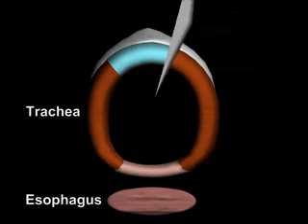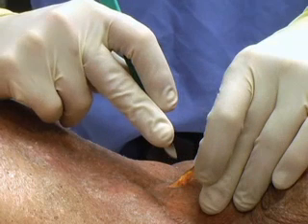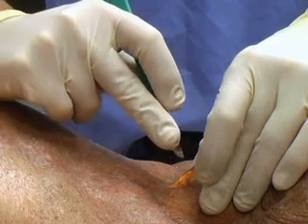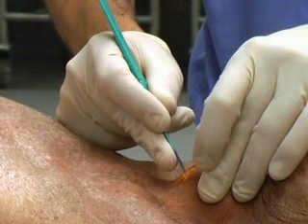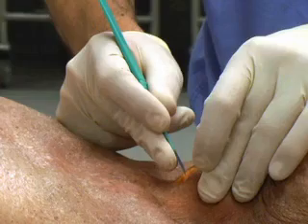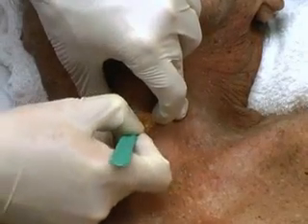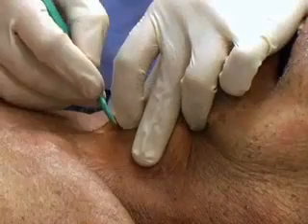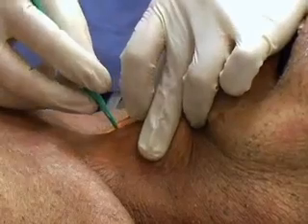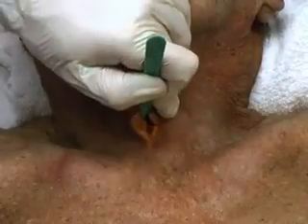1.3 cm deep. To minimize the risk of esophageal perforation, hold the scalpel between your thumb and index finger and allow your middle finger to extend down the side of the scalpel, leaving the distal 1.3 cm of the blade exposed. If the patient is trying to breathe, once you enter the trachea, airflow should be audible and may also be visible. Once the trachea has been entered, make sure the blade stays within the incision so that communication with the trachea is never lost.